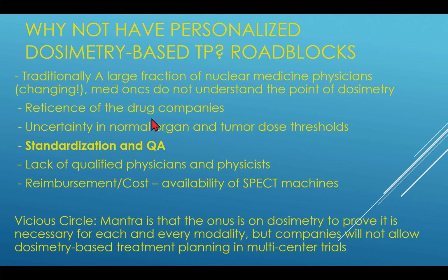So then the question is, if this is going to be so good, and we've seen the results, so Ginu showed the Dosisoft results, right? When this prospective treatment planning, using the technetium-99m information to then plan how much activity to give to the patients of yttrium-90 microspheres, changed the overall survival from 10.6 to, what is it, 26.7 months. And we think maybe we could get the same thing in RPT. Why are we not doing this?